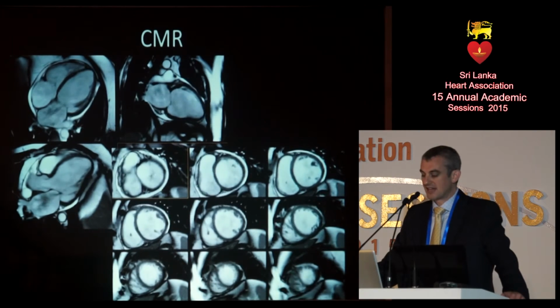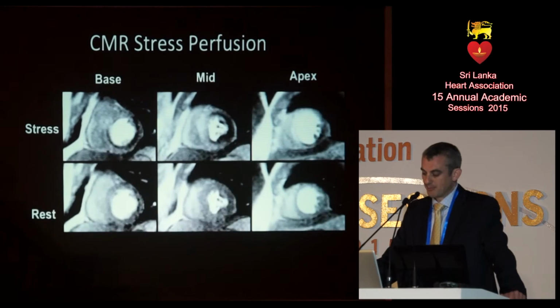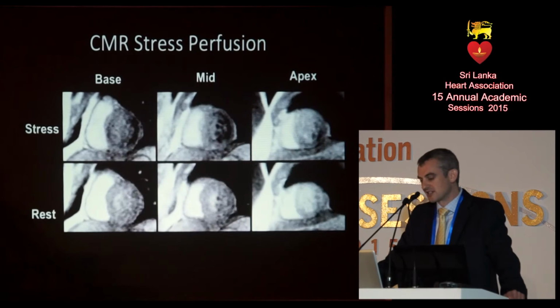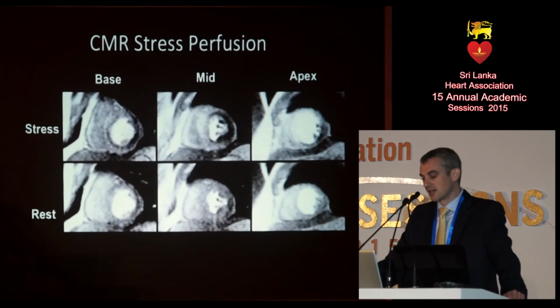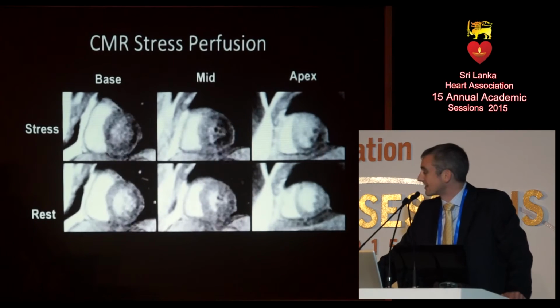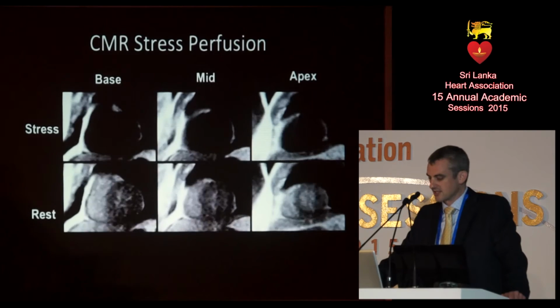Here's his MRI scan really confirming a dilated and poor left ventricle. This patient actually had perfusion imaging as well as late gadolinium enhancement, just because of his risk factors for coronary disease. The top line here is the stress imaging, and I think that probably projects pretty well. You can see that there's a clear defect in perfusion in the lateral wall. That's the easiest to see. Also in the inferior wall, perfusion slow, and probably going around into the septum as well.